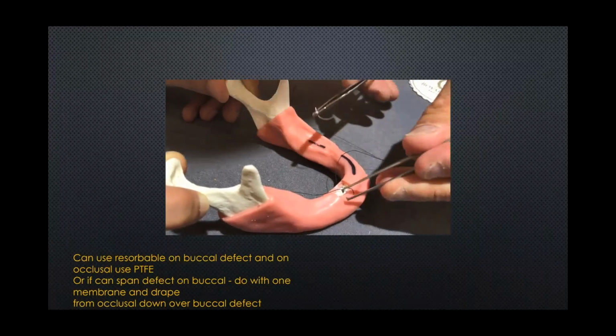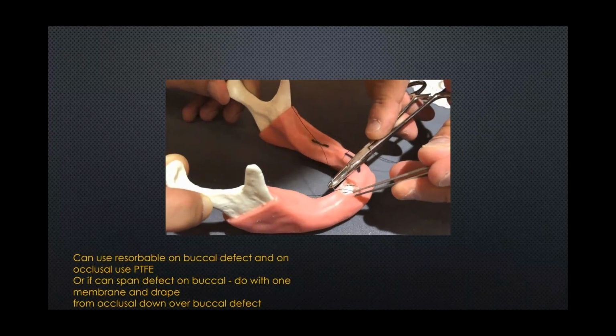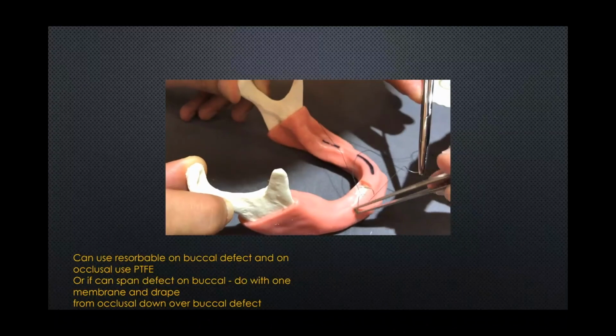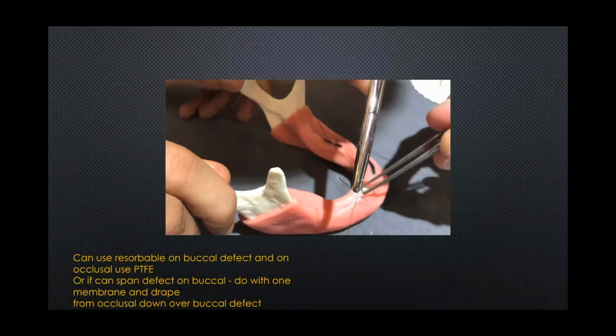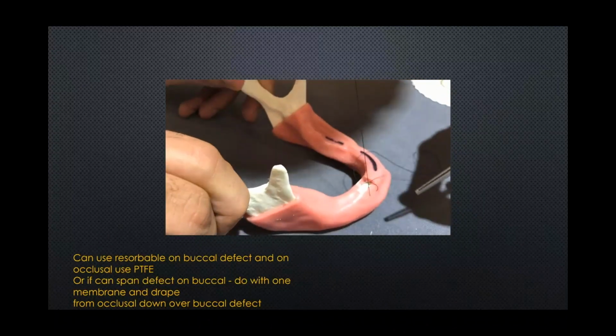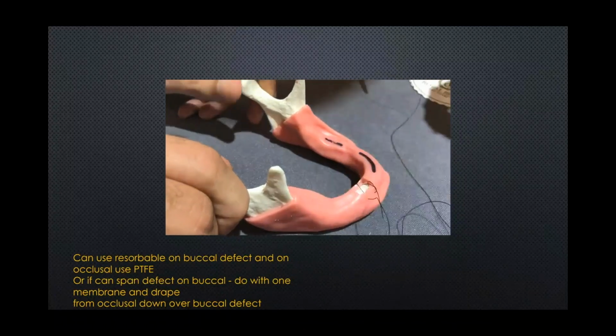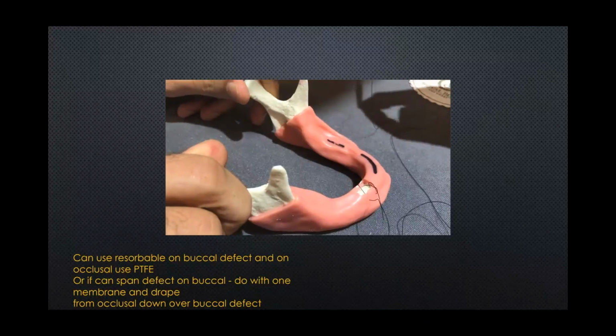Okay. Once again, remember to square your knots too. I think that's the key to a good surgeon. It's just taking your time. Square your knots. There's less chance that your knots are going to slip. And remember, patients judge us on how we do as far as pain. As long as we don't hurt them, they like us. And we could tell as surgeons, though, if we're looking at somebody else's knots, take your time.